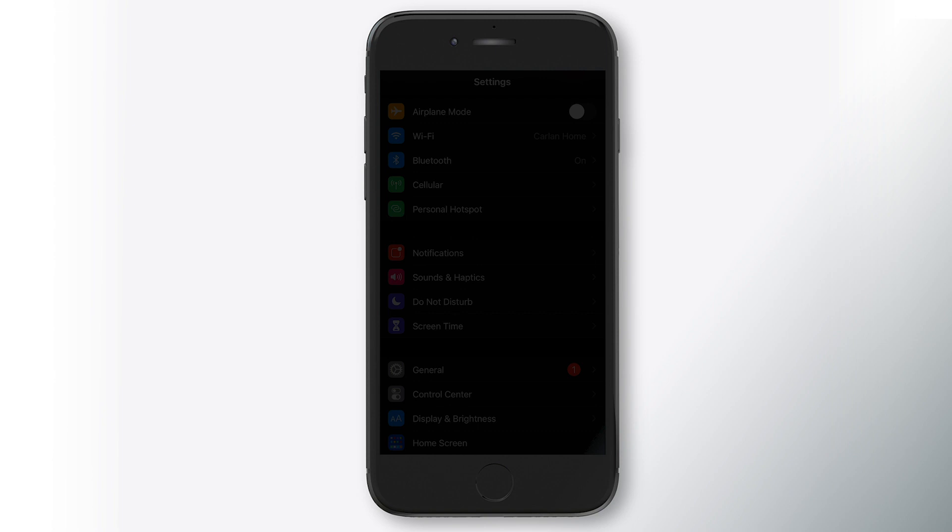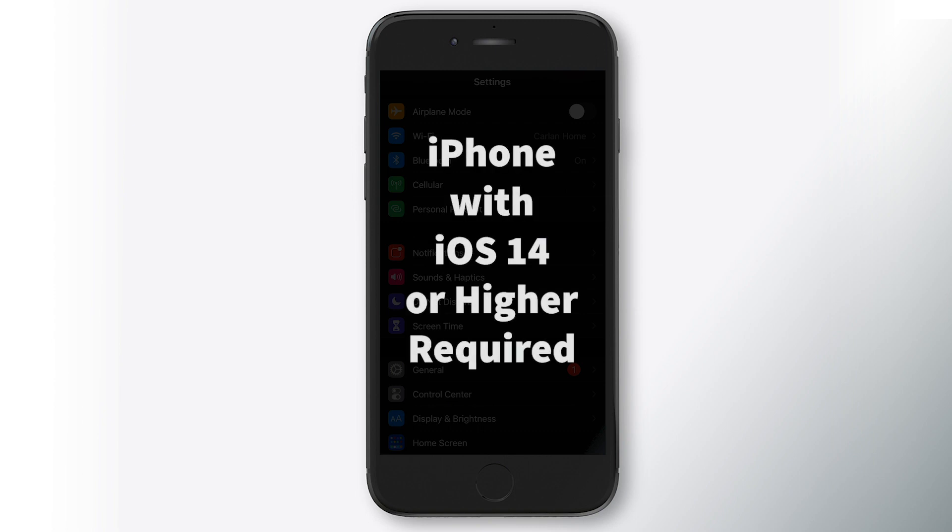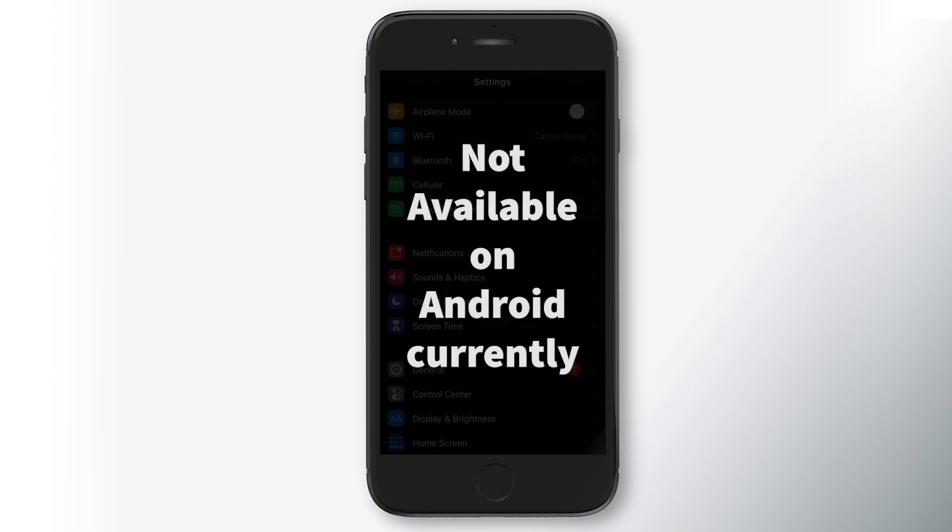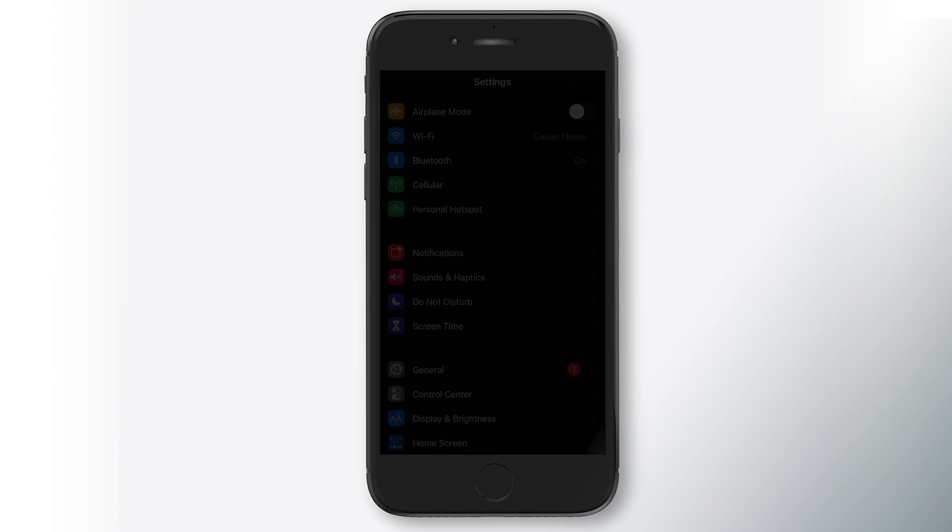Just a couple of prerequisites here. Number one, you have to have iOS 14. You have to have an iPhone that supports iOS 14 to be able to do this. It's not currently supported by Android. Although if you do have an iPhone or your friend has an iPhone, you can set it up and it will retain the settings in your AirPods and you can continue using them and connect them to other devices. But you will need an iPhone with iOS 14 to set it up.